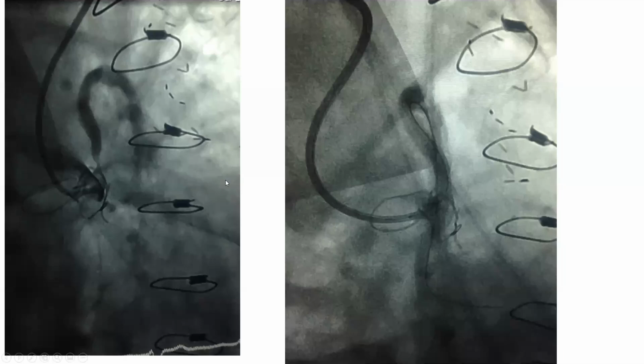This is another case of a super difficult left graft to OM, and you can see, look at that curve here. It's vertical up, then vertical down. I was able to engage it with AL2, but it's such a difficult case to wire, but especially to deliver devices and position stent, that I believe it will be more risk to deploy and deal with a distal basket than to not do it at all.